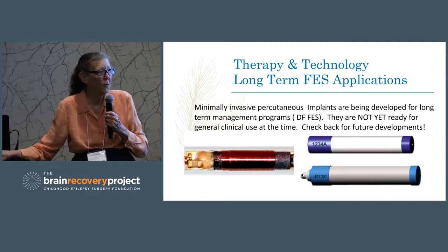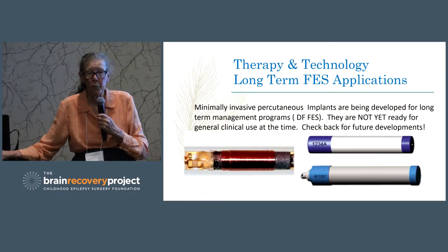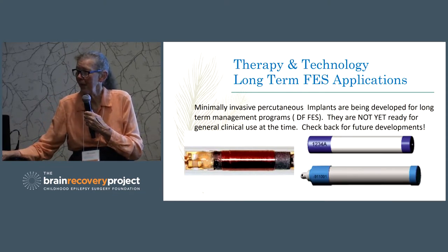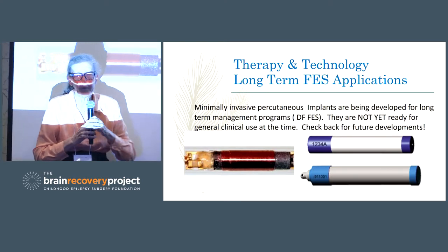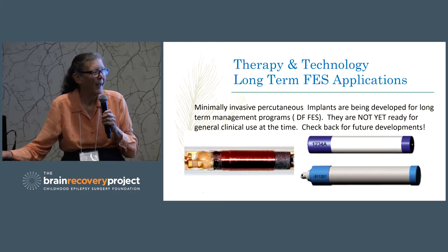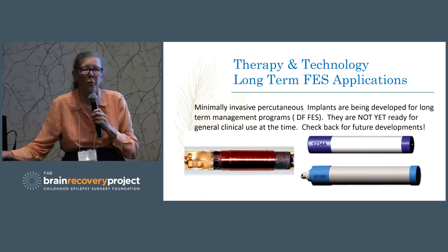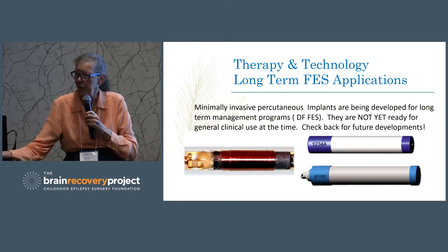And you have equipment that you program it with, so another thing that's nice about these is one thing that we're working on developing is sensors from the stimulators so that we can use the tilt sensor if it's part of the actual implant. And that way we don't have to use any external equipment. So you basically turn it on, use it all day, take it off, turn it off, and it's ready to go for the next morning. So long-term management, we're looking at implanted systems.